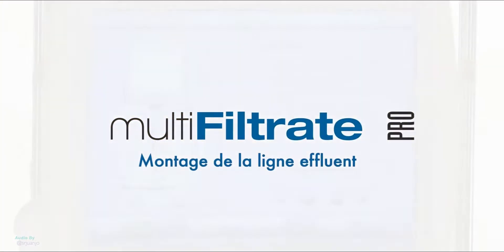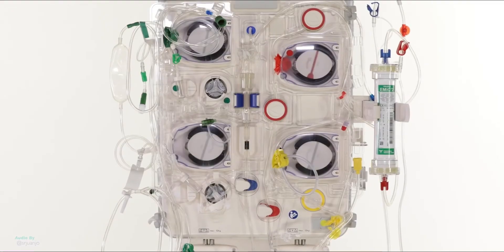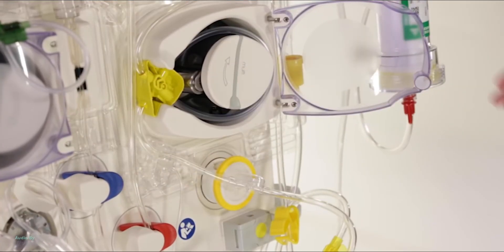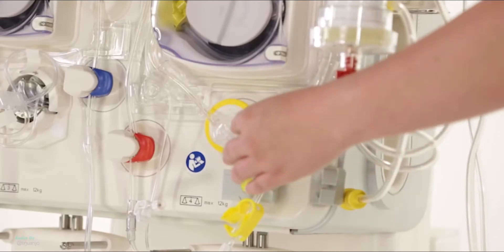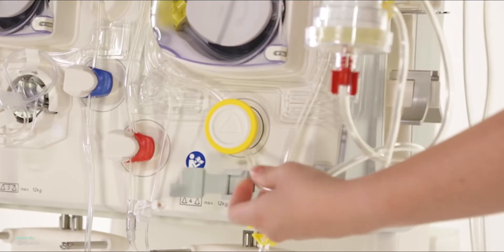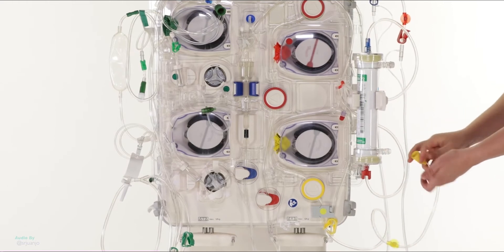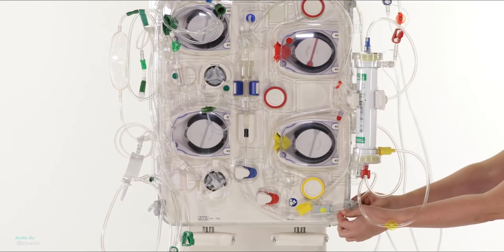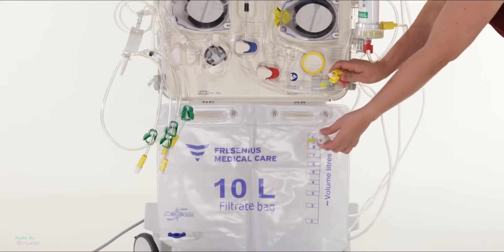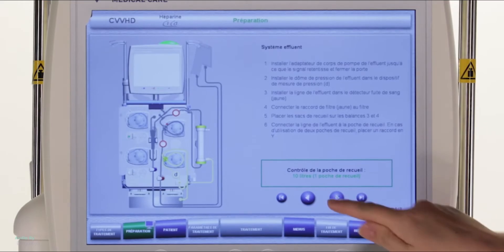Mounting the Filtrate system. Install the filtrate line, identified by the yellow color. Place the yellow positioner in the filtrate pump until the sound signal is heard. Close the door. Install the filtrate pressure dome. Insert the filtrate line in the blood leak detector. Connect the yellow filter connection to the filter. Place the filtrate bag on scales 3 and 4. Connect the filtrate line to the filtrate bag. Continue by pressing Next.